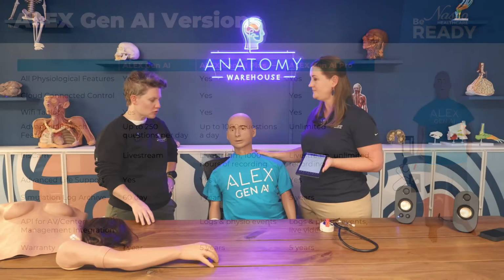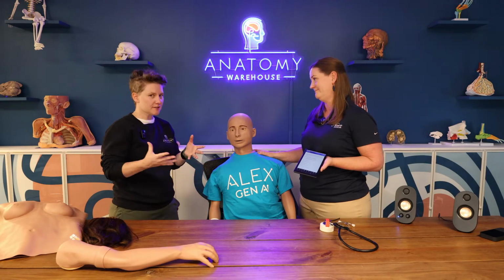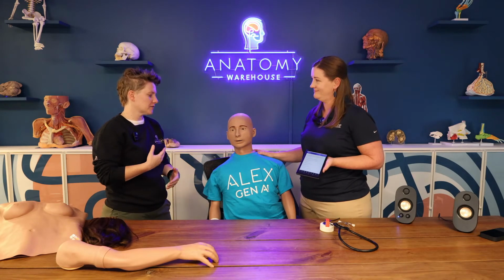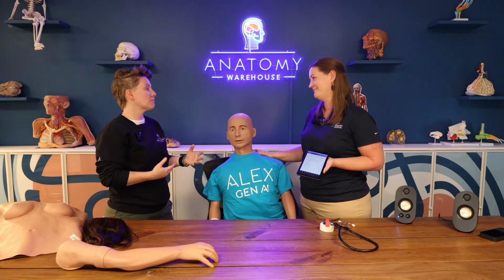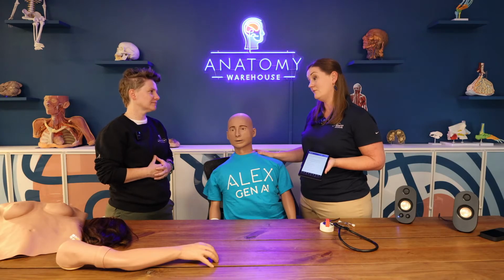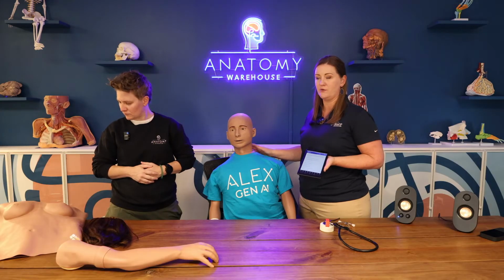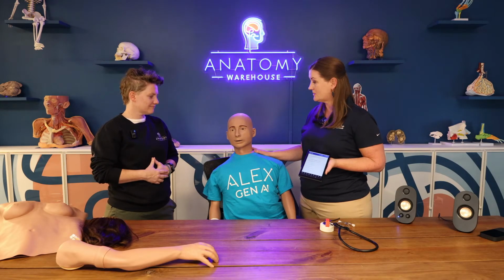Yeah, I think it's so cool that the software component isn't like hardware where it's stuck in its configuration forever. You guys are allowing students and educators to give more and get more out of the mannequin. So the modularity is really clever. I love it. Yeah, for sure. And then the IV arm, the female update kit, gives the mannequin the additional voices. And yeah, he works pretty slick.